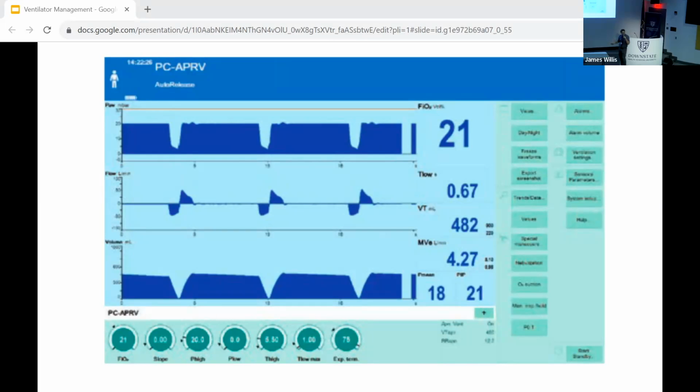Only every 5 seconds, you cut the CPAP for a split second, and then bring it right back up to that same CPAP. So it's CPAP with little intermittent breaks. And the patient is essentially breathing up at that CPAP. I want you to take a second to imagine what this feels like. Take a deep, deep breath. And don't completely exhale. And take smaller breaths right at where you are right now.